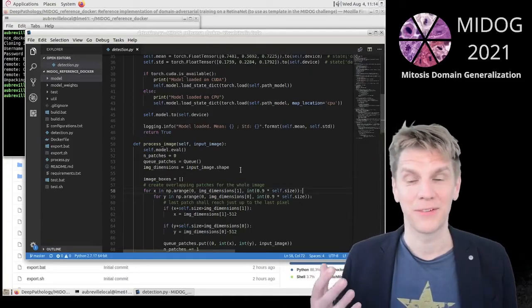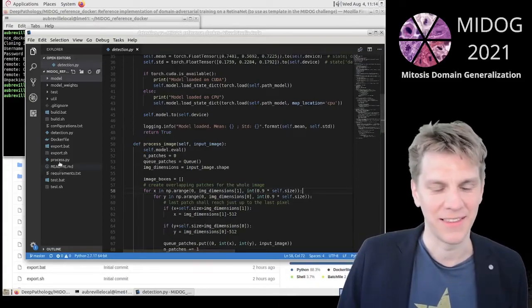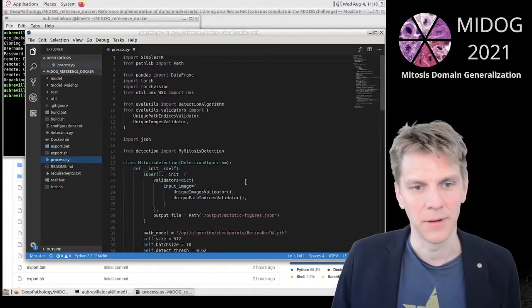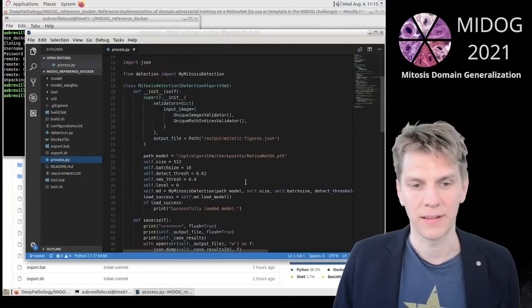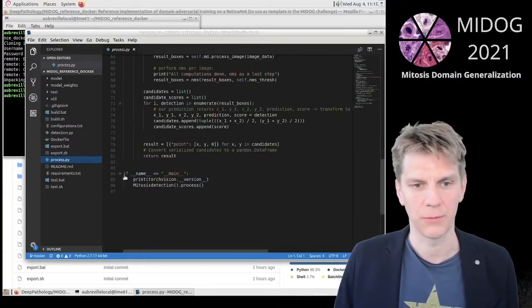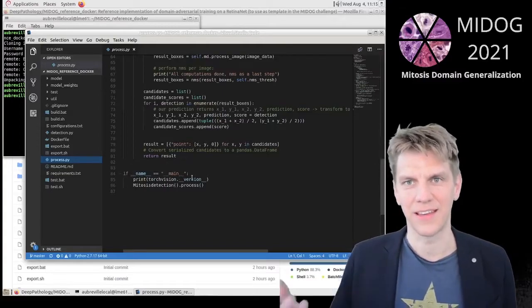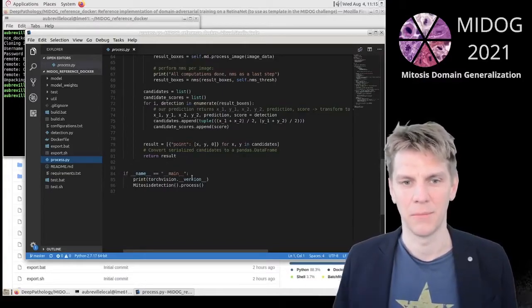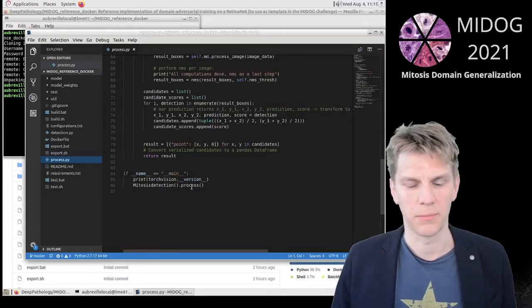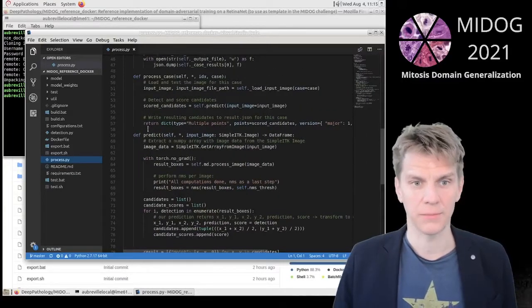Of course, now there's the question, where does this NumPy array come from? So let's go into that briefly. So here, for example, we have the process file, and how does it work? So first of all, let's see how it is being run. If name is main, so in this case, the file is run not as a class, but on its own, then we do the processing, and the processing will then do this method predict.